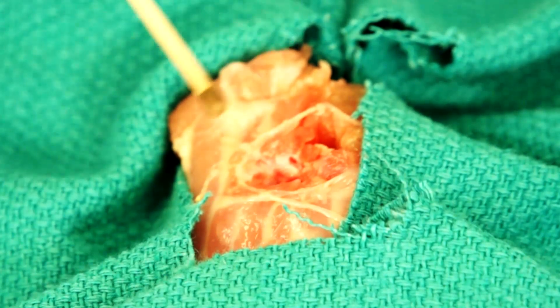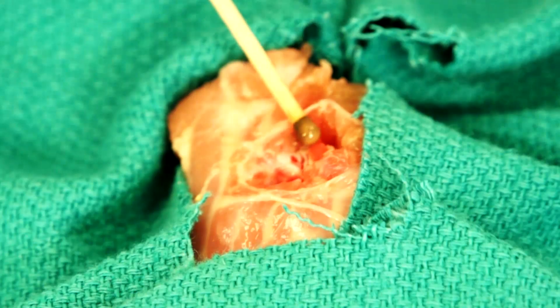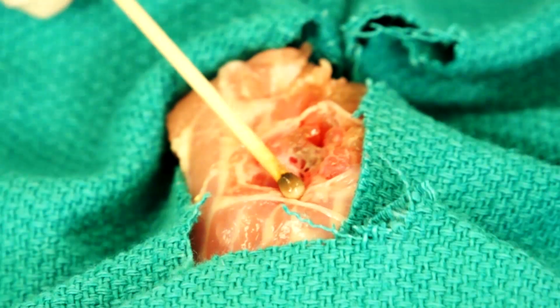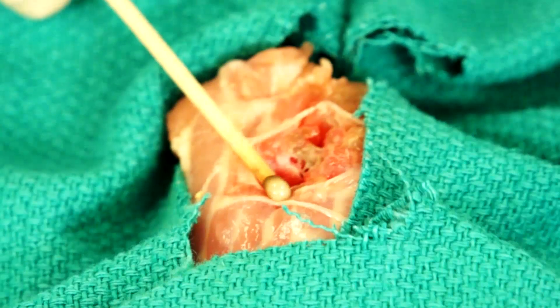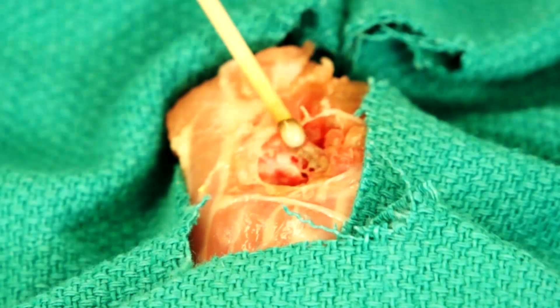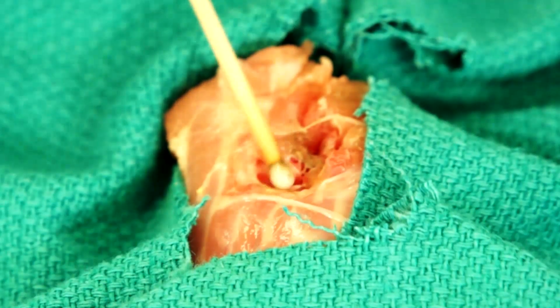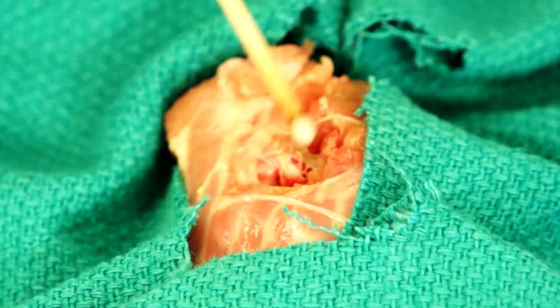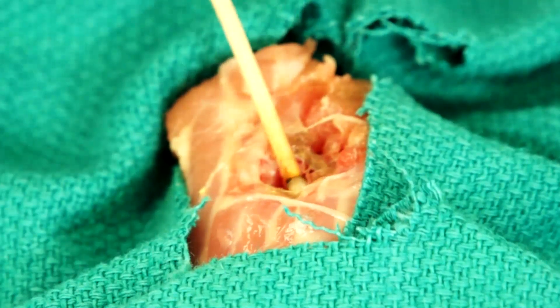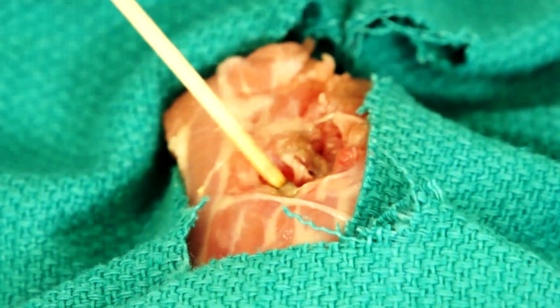Silver nitrate is applied after being prescribed by a licensed physician. It is then applied to the area of hypergranulation as being demonstrated here. The silver nitrate is the portion you see on the tip of the applicator. It can be applied to the area of hypergranulation by rolling the applicator throughout the course of it, and you will see that as it is applied, the tissue starts to turn gray to black. Once the silver nitrate has been applied, a wound dressing can then be applied over the wound. The application of silver nitrate as a chemical cauterization agent for treatment of hypergranulation may be required on more than one occasion.